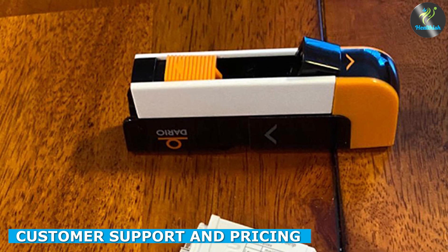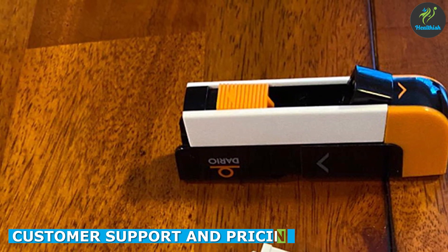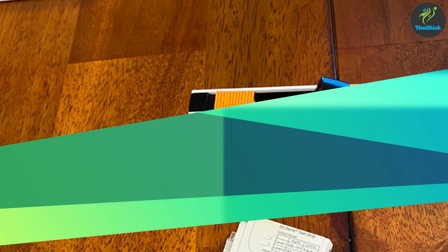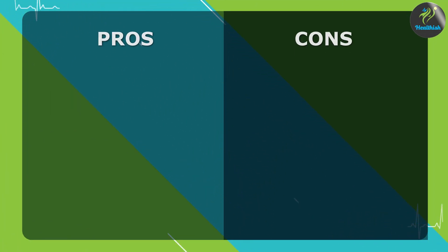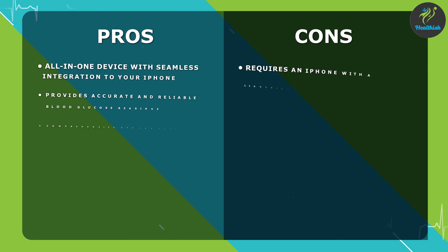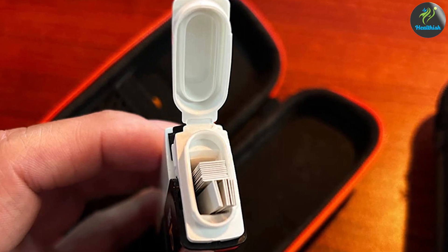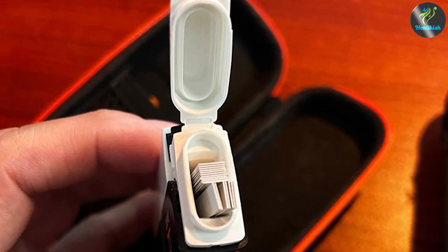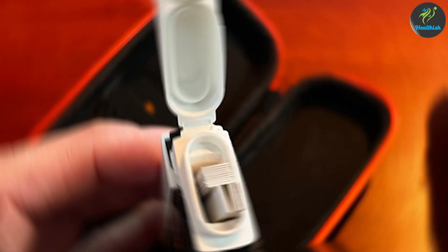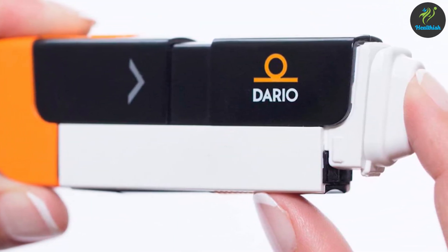When investing in a health device, excellent customer support is essential. Dario is known for its responsive and helpful customer service team. They offer prompt assistance and are readily available to address any concerns or questions you may have. In terms of pricing, the Dario Blood Glucose Monitor Kit offers great value for money. It's competitively priced, especially considering its advanced features and seamless integration with your smartphone.